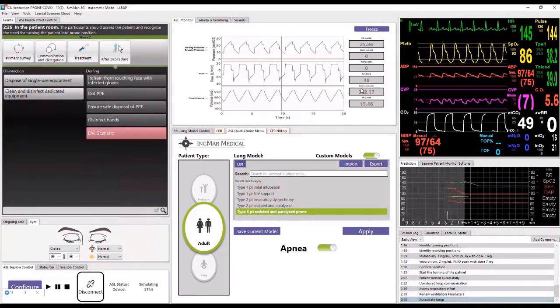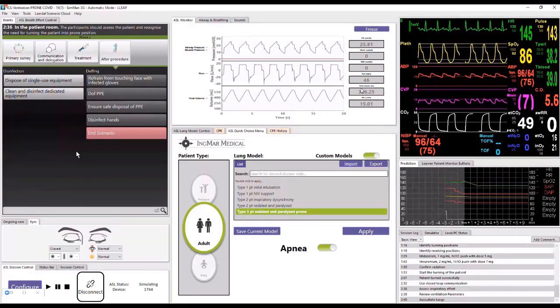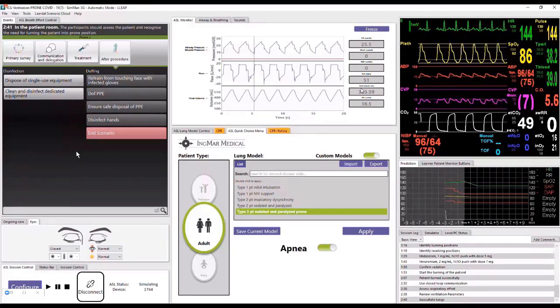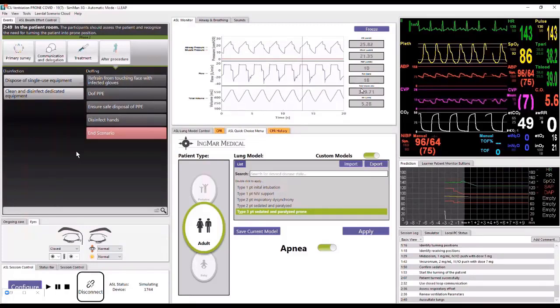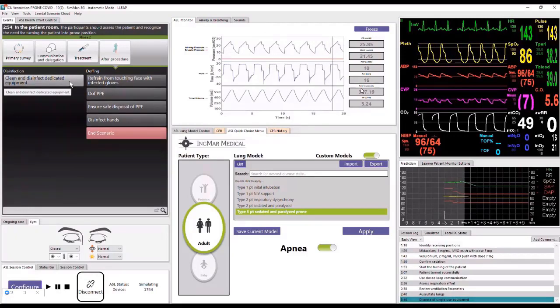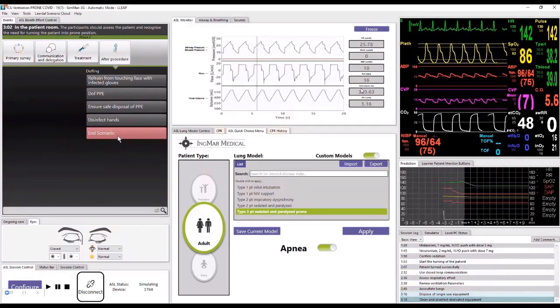If they choose to show the X-ray, that will show up also on the patient monitor. Then after the scenario, they have the option to doff and remove any of the single-use items from the area. You'll notice that when we built these scenarios, we built them with some consistency across the three, because we understand at this time we want scenarios that are functional, but also allow you to have an opportunity to follow a patient through the COVID-19 experience.